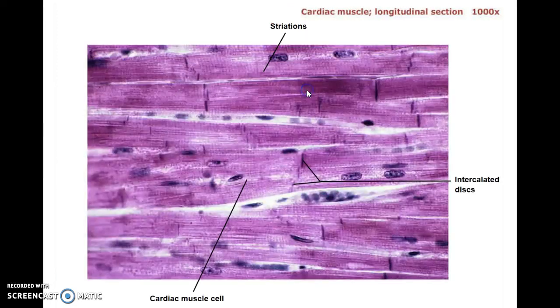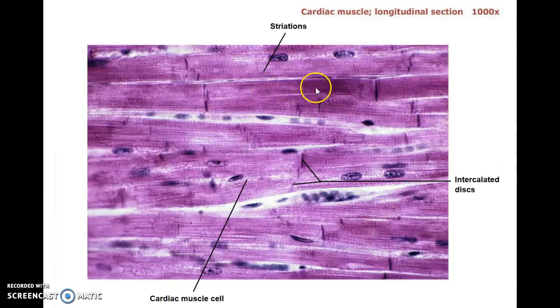There you can nicely see the striations. More cardiac muscle, really nice striations. You can see the cells sometimes kind of split, and they connect at those intercalated discs, which are all over the slide.